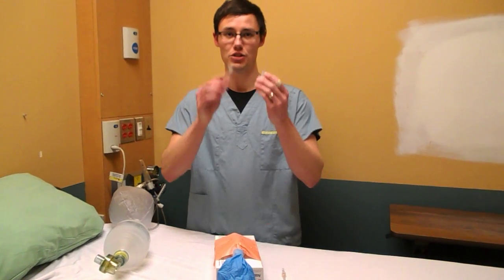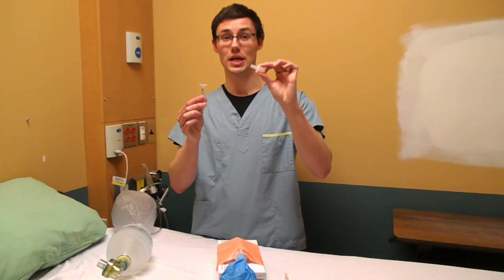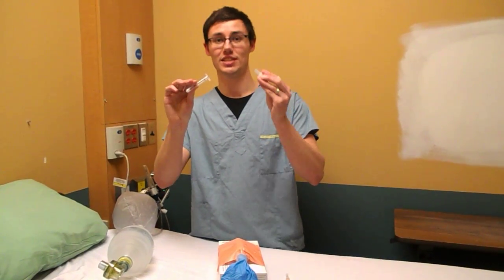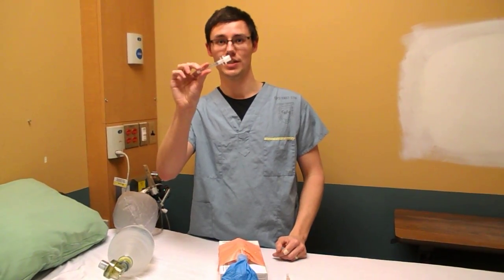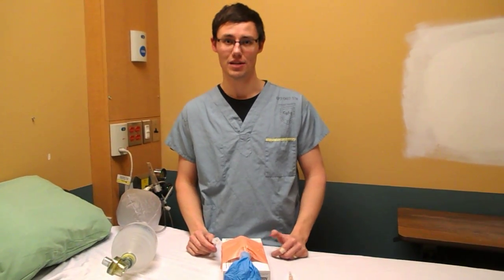Then, you're going to need these two pieces of equipment. This is the adapter from a 7-0 endotracheal tube, and this is a 3cc syringe. The reason why you need these two exactly is because the 7-0 endotracheal tube adapter fits snugly into a 3cc syringe. This is going to allow you to MacGyver a lot more things than you think about in the future.